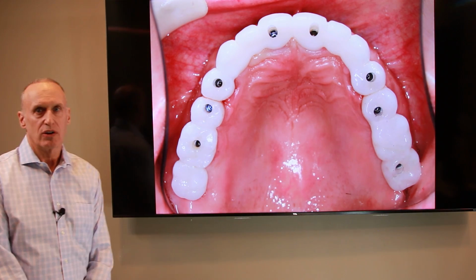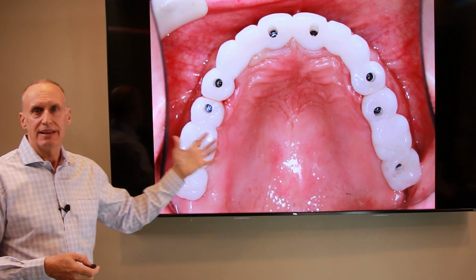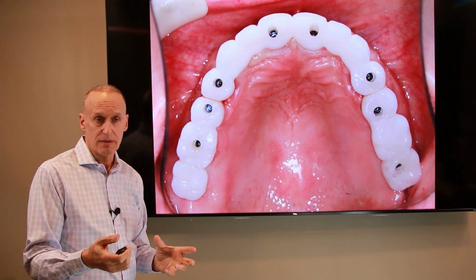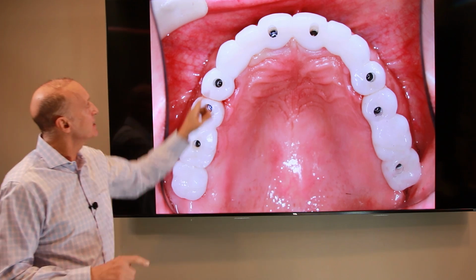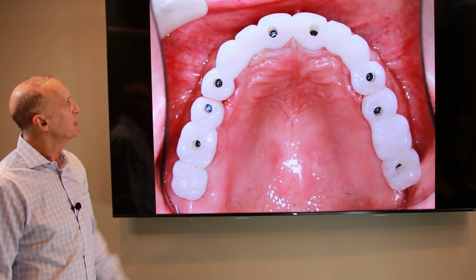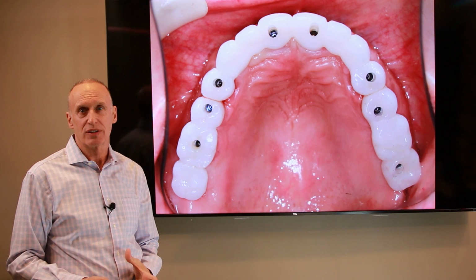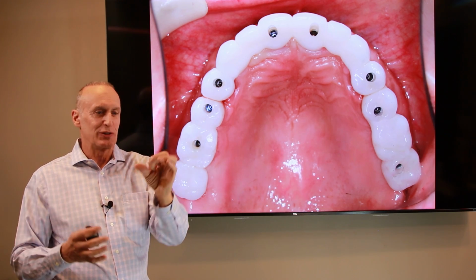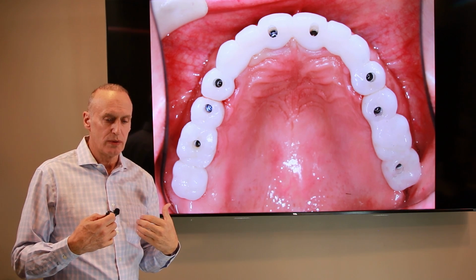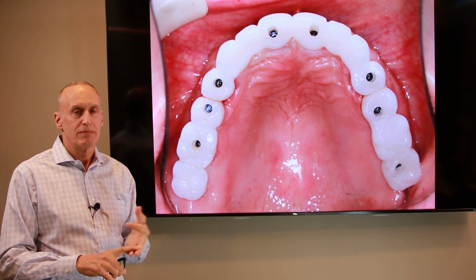So when I mentioned the difficulty, one of the reasons that implant bridges are so rare and cost more is the precision necessary to place these implants exactly where they need to be to support the patient's implant bridge, to be cleansable, and to not show when they smile. These holes do get filled in with white filling material called composite resin, but you can imagine if that hole is on the front of the tooth and we have to put a white filling material in there, it's going to stain over time. You're going to have this beautiful tooth around this little dot of dark stained composite. So imagine any of us doctors who do implant bridges, this is time and energy and precision, and it takes longer.